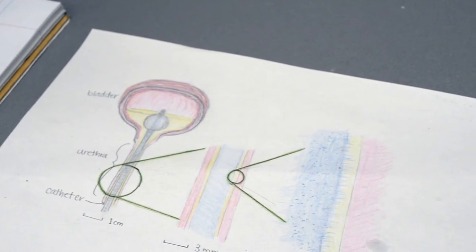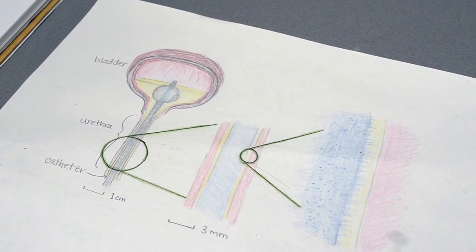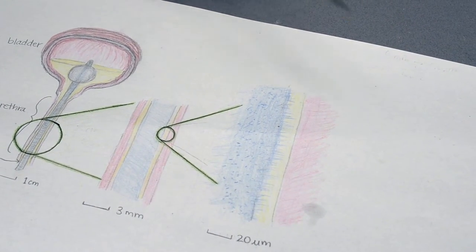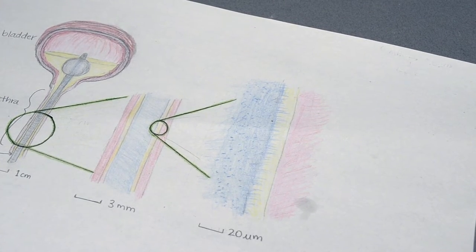Looking more closely at the design of this reinvented catheter that would mitigate the risk of UTIs, here we zoom into the catheter surface at a nanoscale. The nanotopology would be embedded on the catheter surface to prevent bacterial growth and thus infection.